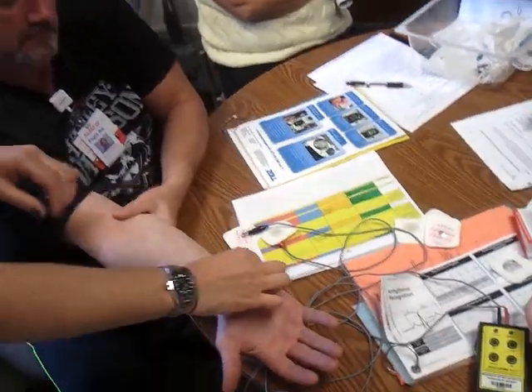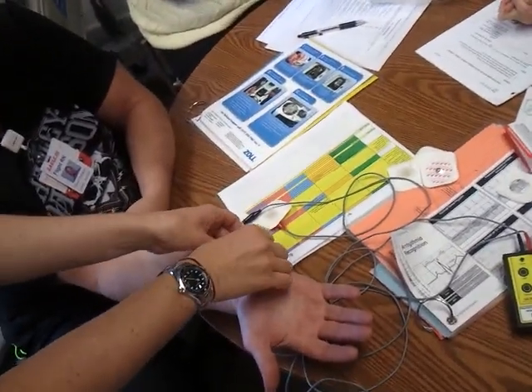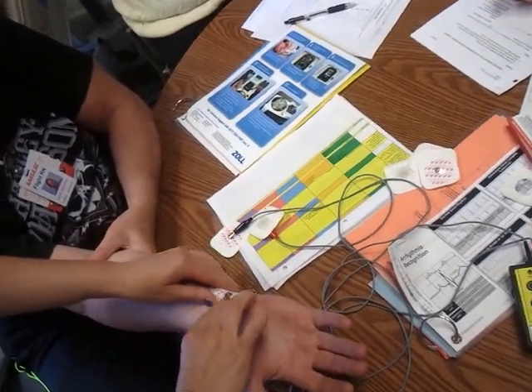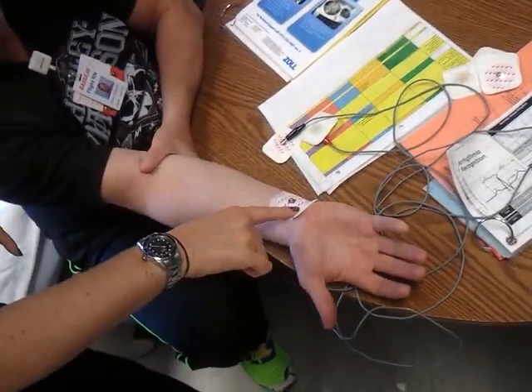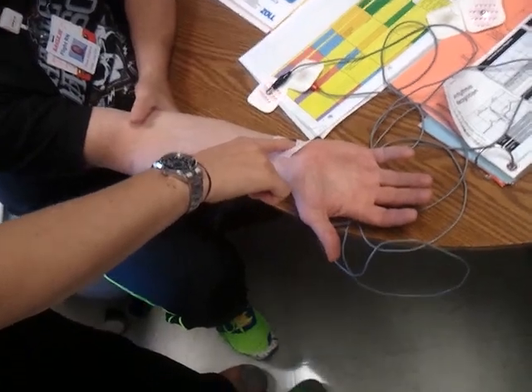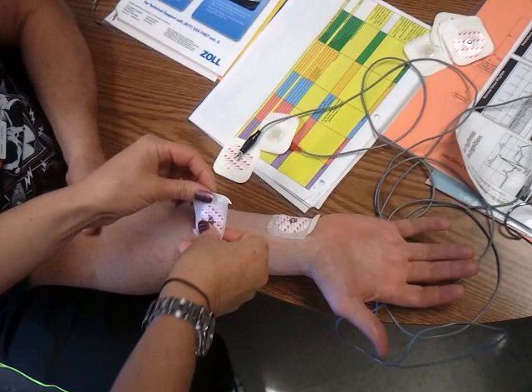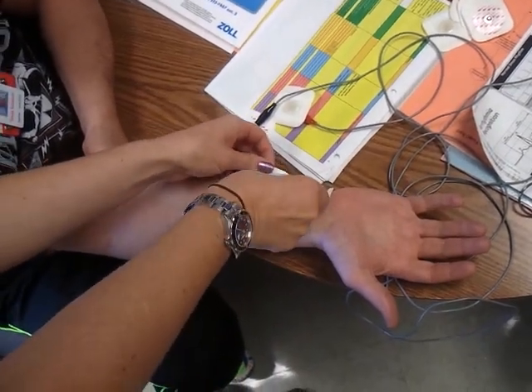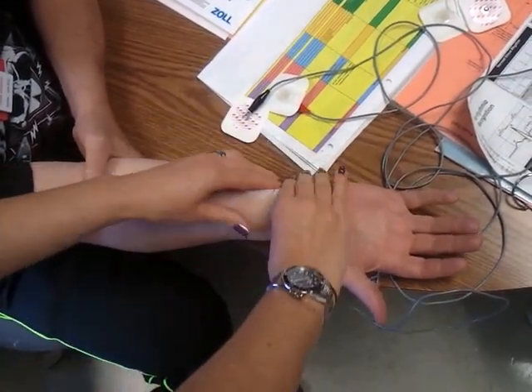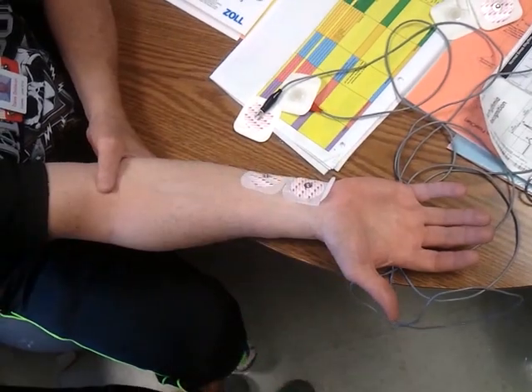The patches line up with the ulnar nerve. I don't even think we can move this over a little bit. Line up with the pinky. You're going to put one on the wrist area and then one about three to five centimeters up. So really they're kind of right next to each other as far as patch placement goes.